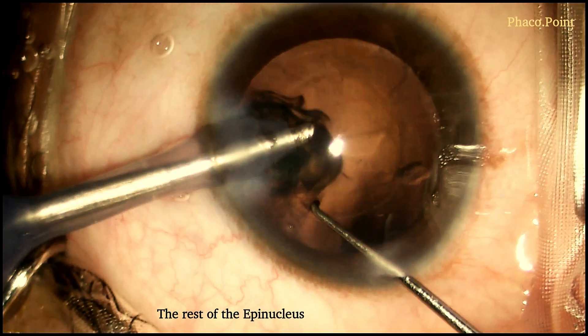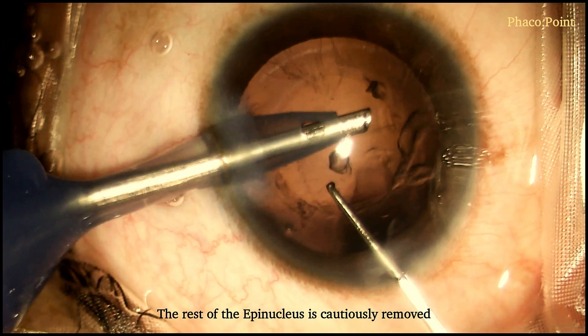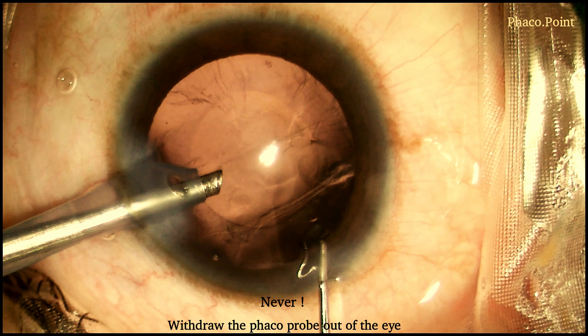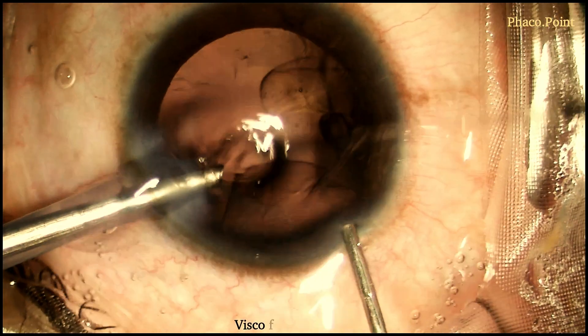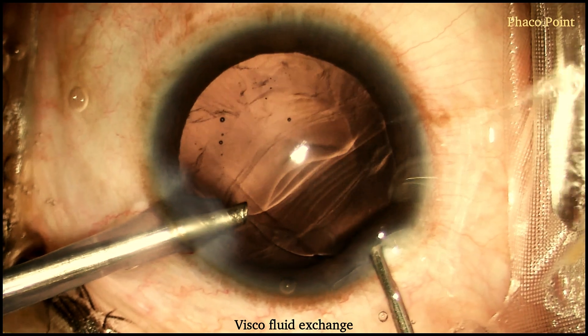Whilst the phaco probe is in the eye with the irrigation on, and we notice the tear occurring in the posterior capsule, it's extremely important at that point not to withdraw the phaco probe, because that's going to make the anterior chamber shallow and get the vitreous to herniate into the anterior chamber. At this point, you withdraw the Sinski hook and whilst maintaining the irrigation still in the eye, perform a viscofluid exchange.